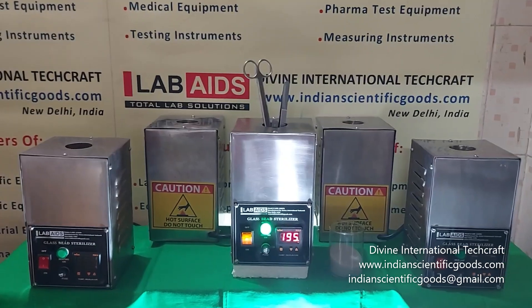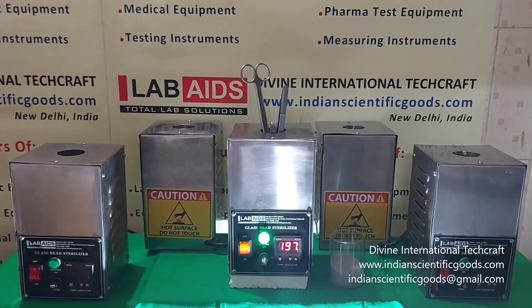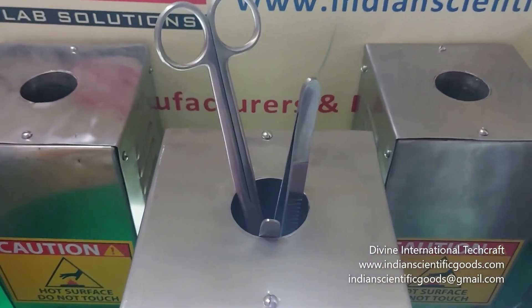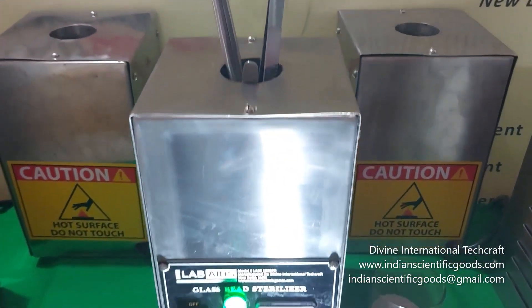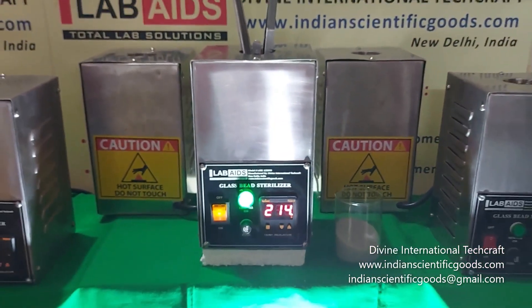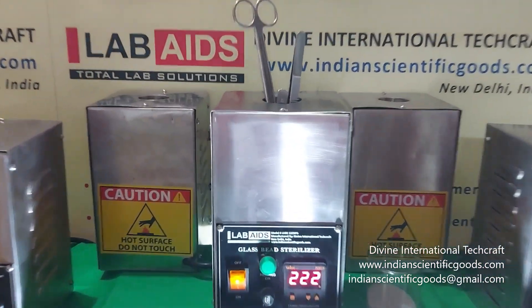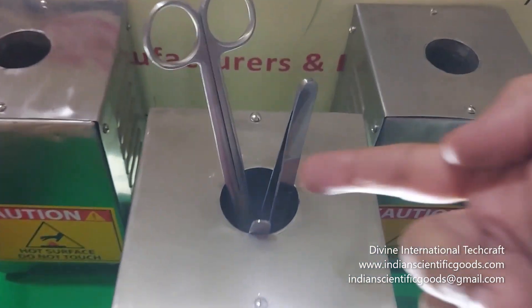These are mainly used for sterilizing the working ends of small instruments like forceps, scissors, blade holders, scalpels, endodontic files, reamers, etc. The instruments to be sterilized are placed in a container containing glass beads.